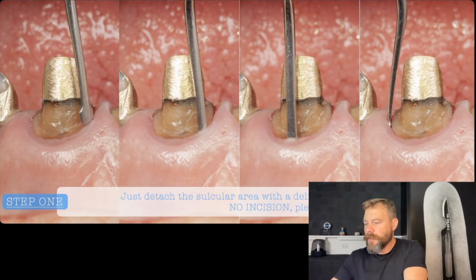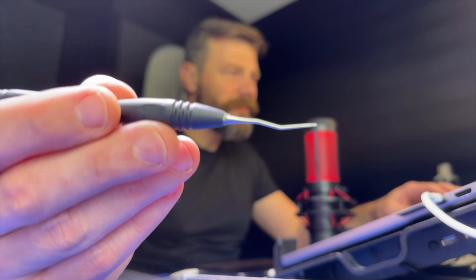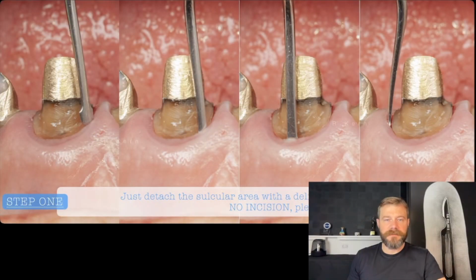Okay, so the first instrument that I'm going to talk about, let me check here inside the box. It's a super delicate tunneling instrument. Okay, exactly this one here. You know, I'm going to bring this instrument also in macro view, don't worry about that. I'm going to use this instrument to start the tunneling step or the tunneling stage.